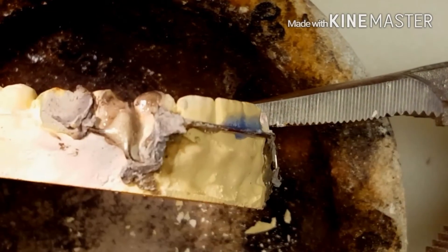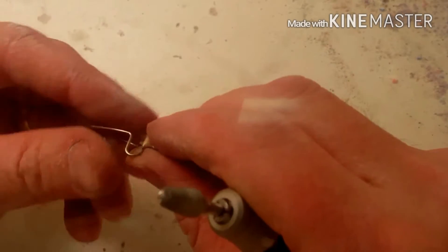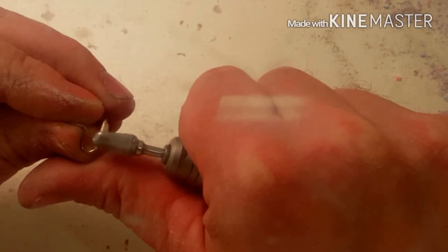After the solder joint cools, you take it off the model and bring it over to the trimming station where I use an E-cutter. Some people go at it pretty aggressive, but you're kind of feathering the metal rather than trimming it.